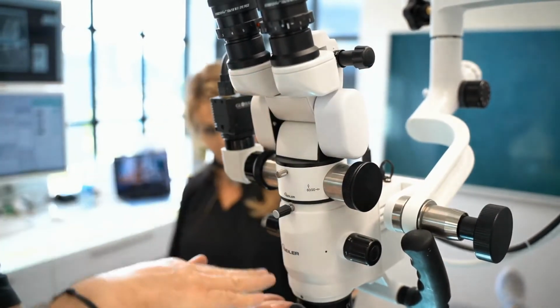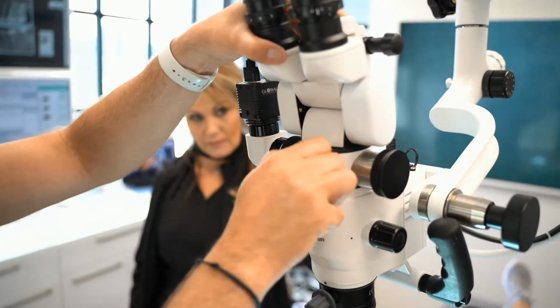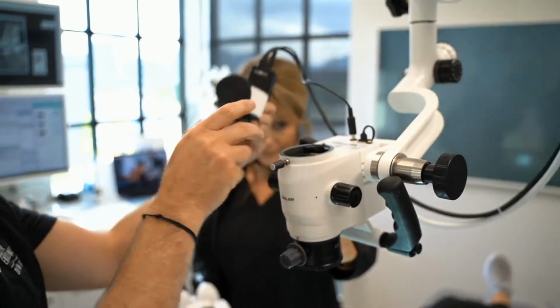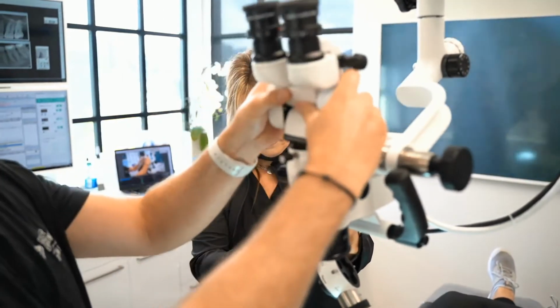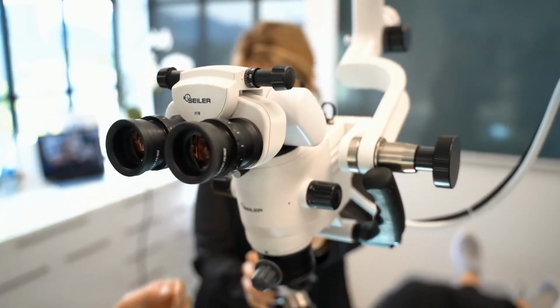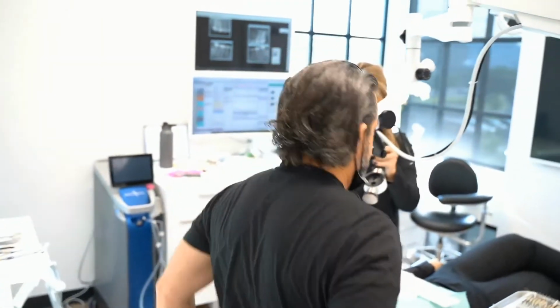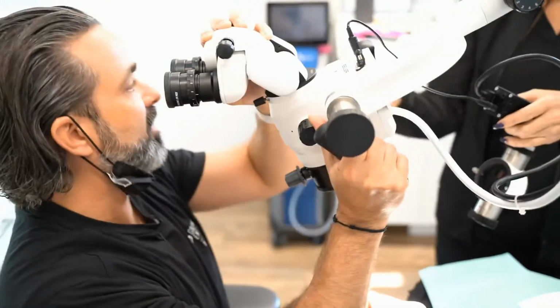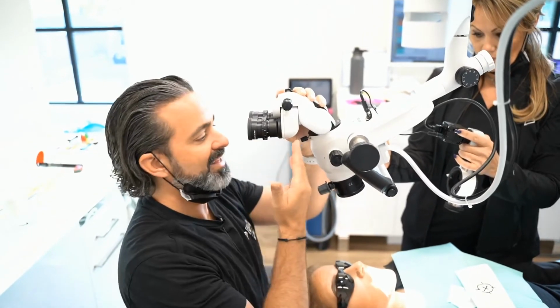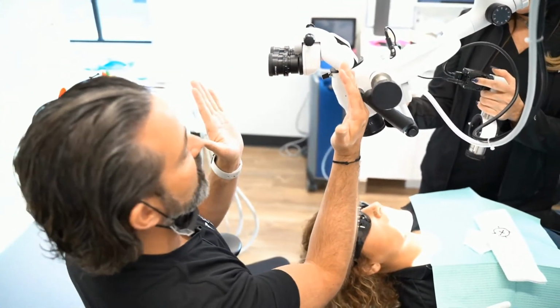It's kind of nice to shrink this distance up. As you start stacking these parts, this scope gets taller and taller. If I were to take this beam splitter off, you can see how small that would get. If I put this on, which is how the scopes really come given to you, it'd be something like this. Now, if I were to sit at 12 o'clock, I end up getting a little bit of a lean for me over her head. I like that distance because instead of leaning forward, I can lean back or I can recline. So I like this distance increasing over here.